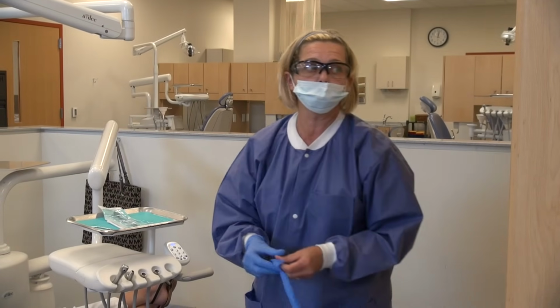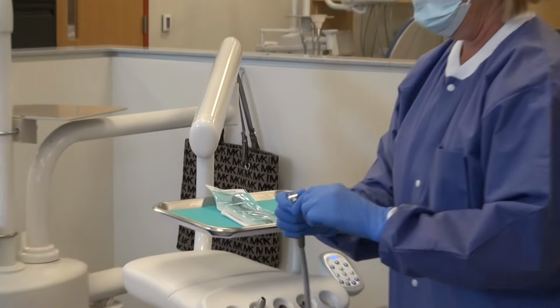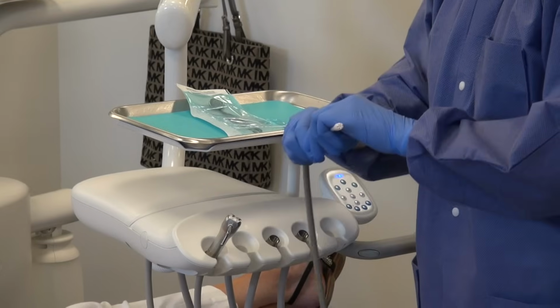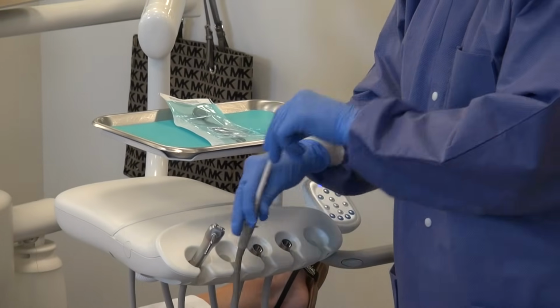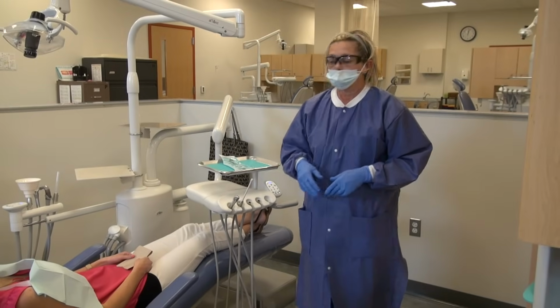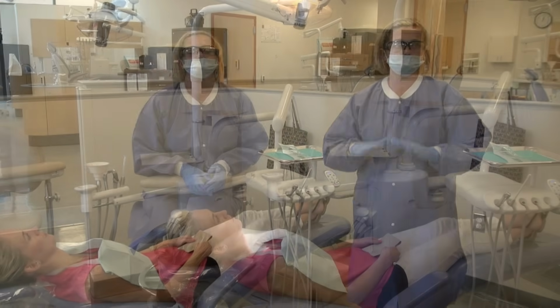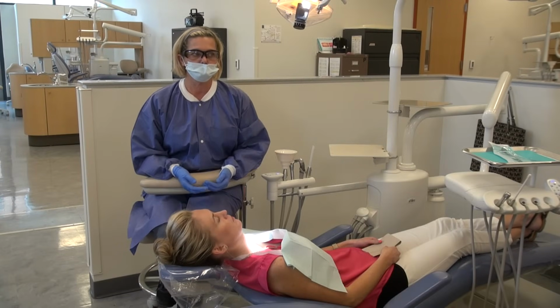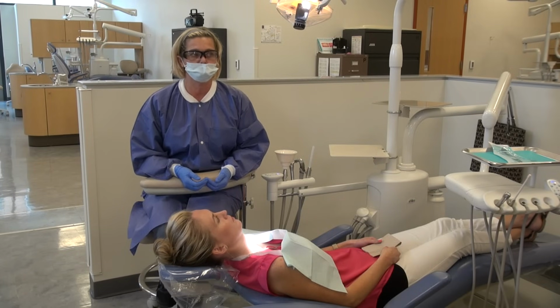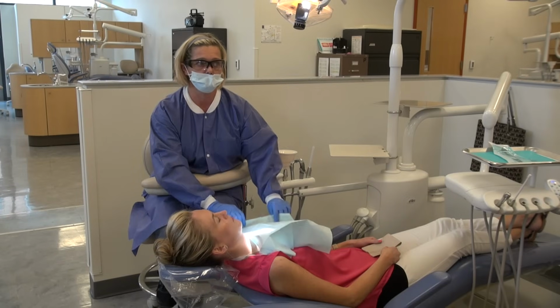At this point, you will prepare the air-water syringe, the saliva ejector, and the HVE if you are using it, and any other instruments that you need for the procedure. At the end of the procedure, you will rinse and evacuate the oral cavity with the air-water syringe and the HVE. You want to wipe any debris off of the patient's mouth with their napkin.